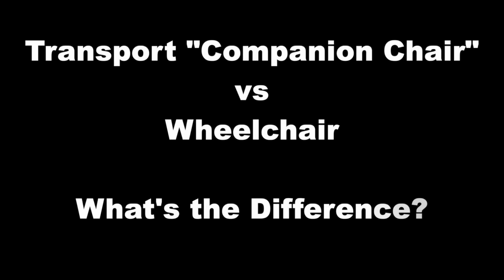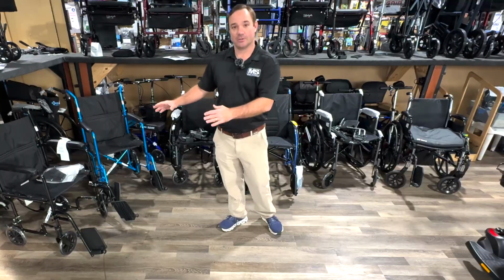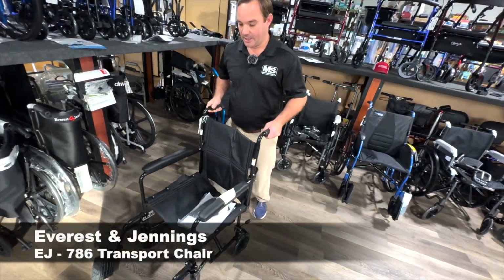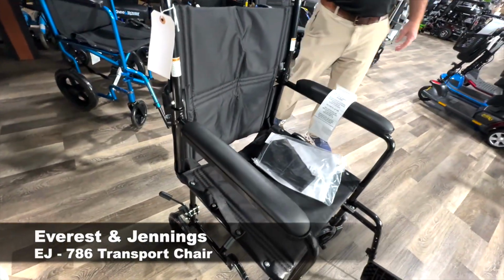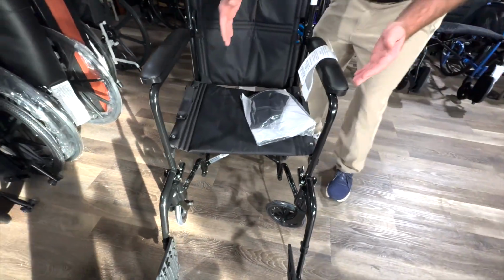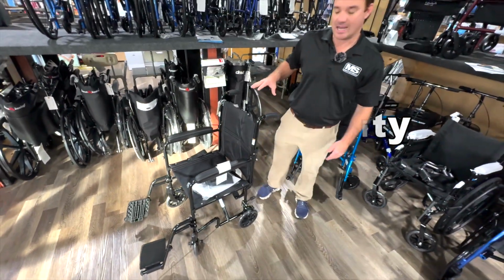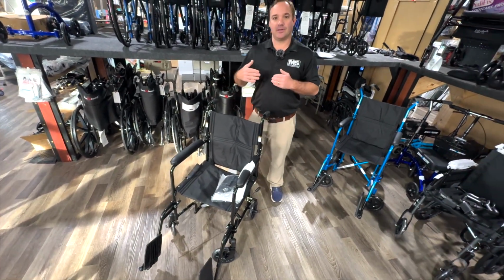A lot of people calling about wheelchairs, but they might need a transport chair. People refer to this as a wheelchair, but really this is a transport chair, or what they might call a companion chair. Usually they come in a 17 or a 19-inch seat. There's no side guard, so if you are a little bit larger, you can come out, and you're usually not in these for long periods of time. So the purpose of this is usually to go to the doctor's offices.